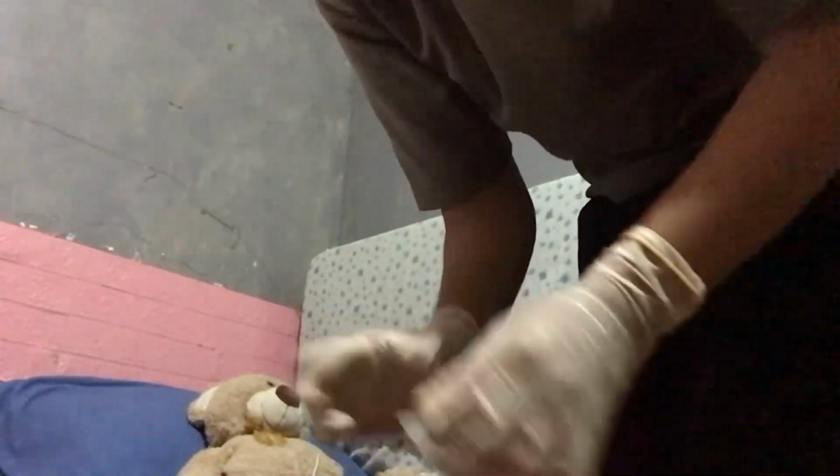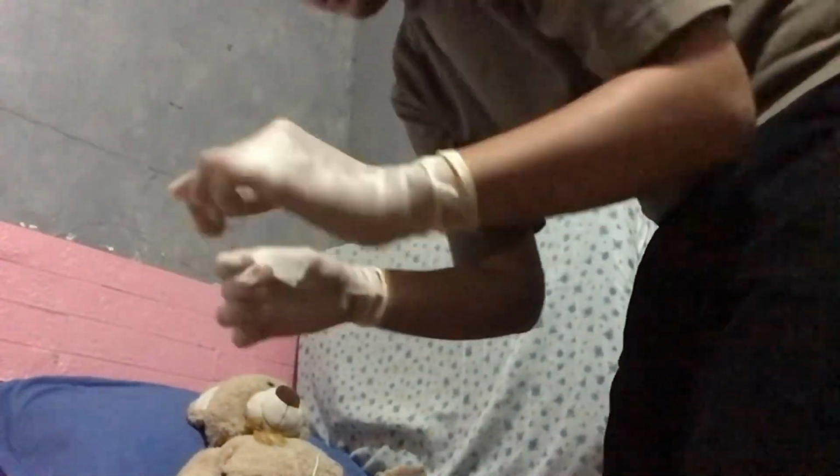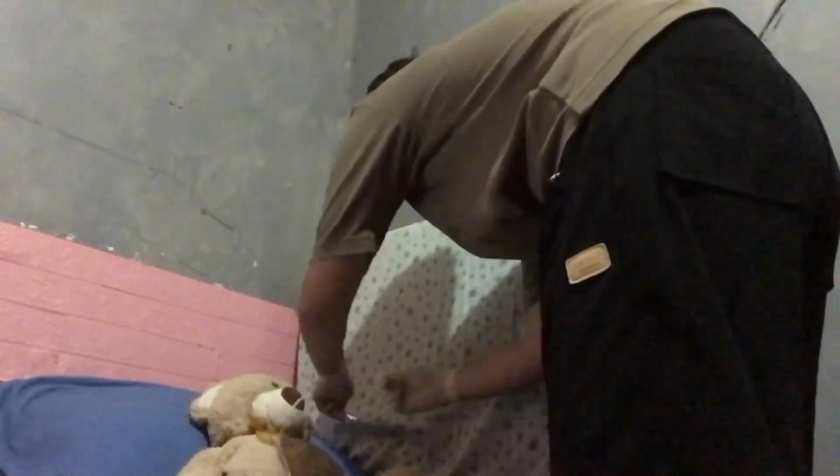So secure the tube. Once the placement is confirmed, secure the tube using tape. So ito natin. So ganyan. Okay, sir.